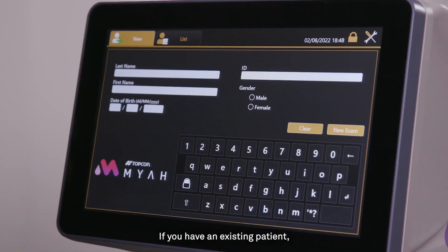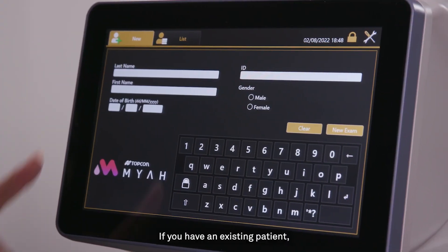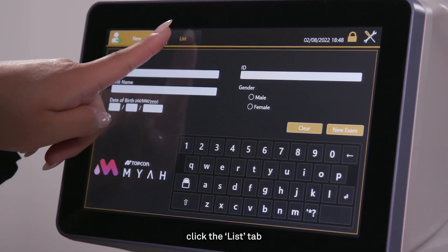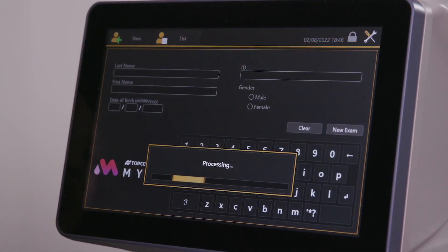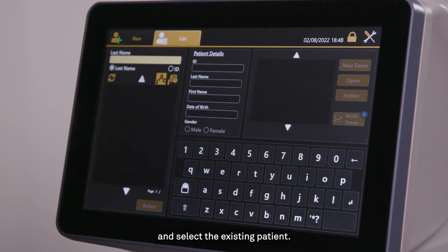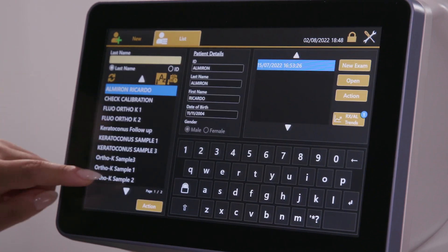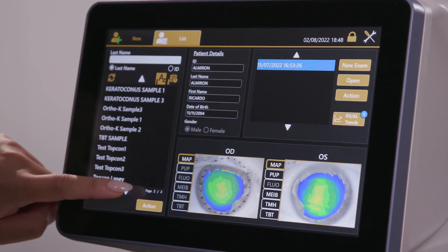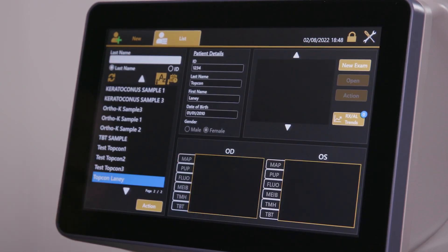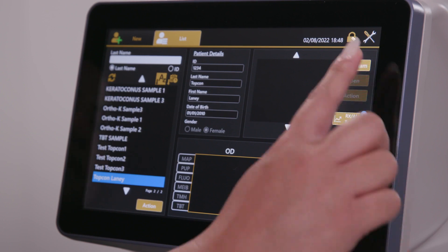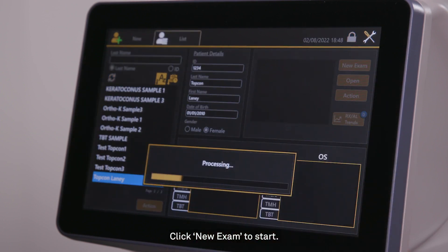If you have an existing patient, click the List tab and select the existing patient. Click New Exam to start.